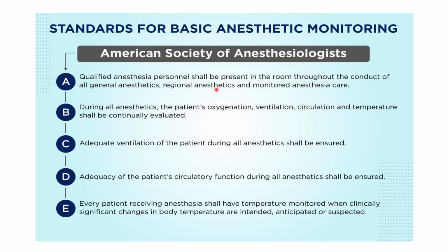This is standard number one. The most important one in the operating theater is the anesthesiologist himself. This is an important question for MCQ and oral exam. After that, everything else comes later.